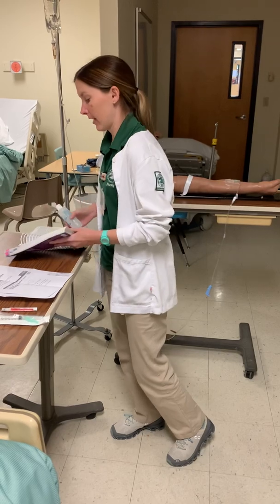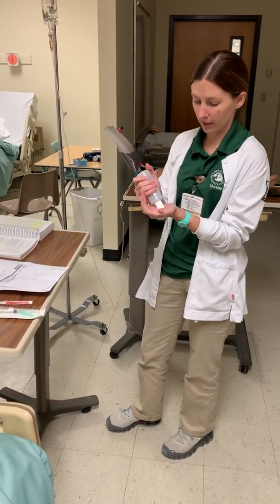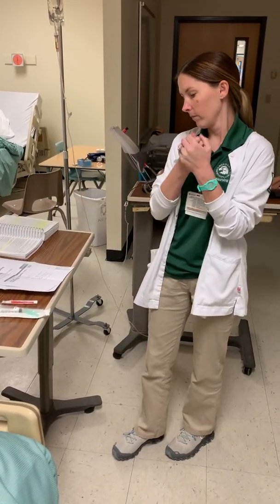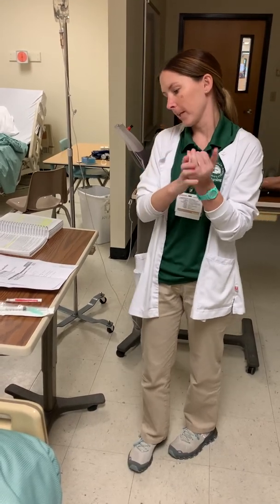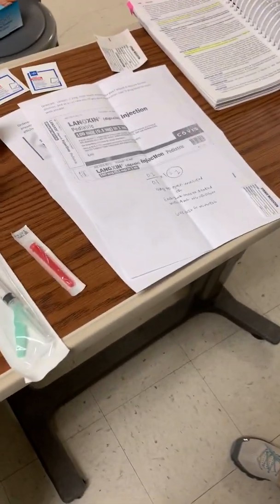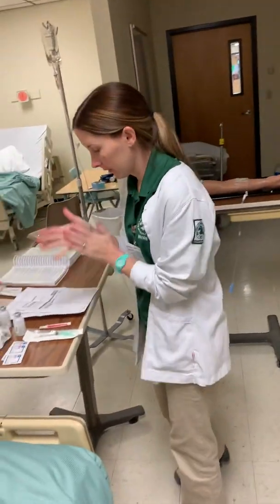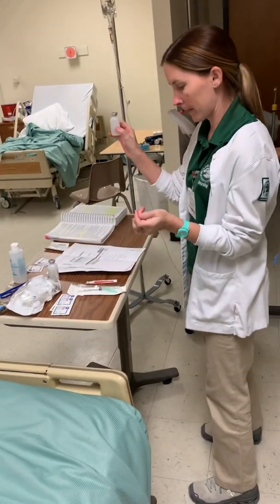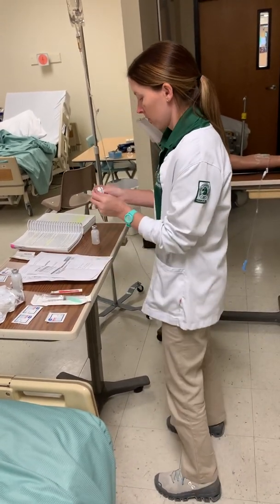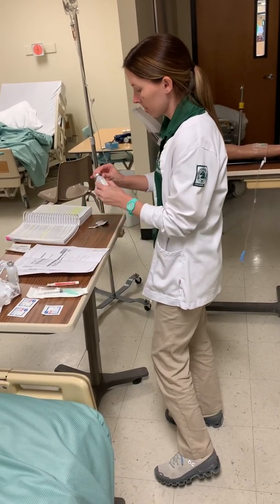So I'm going to set my book to the side, and before I start touching any of my equipment, I'm going to wash my hands. So I'm going to put this in my hands. And I've already worked my drug problem, and my drug problem says that we're going to be giving 2 mLs of this medication. So I'm going to be drawing that up. Okay, my hands are clean. I've got my medication, and since it's already opened, I want to go ahead and scrub the top. Scrub the top for 15 to 30 seconds.